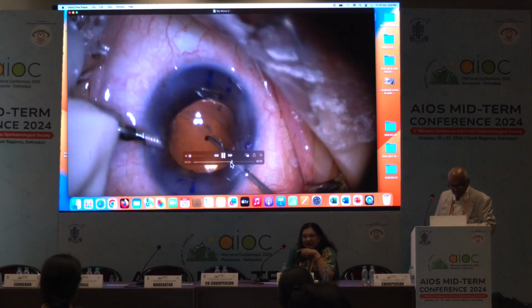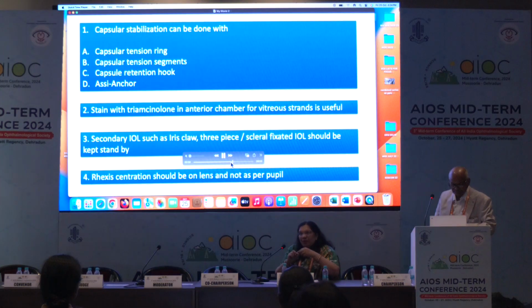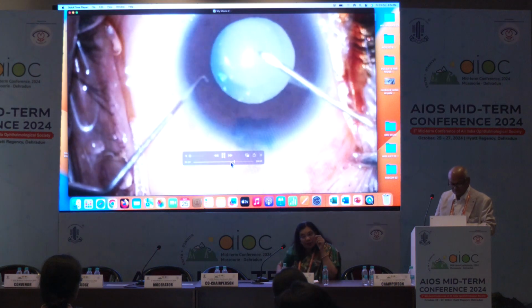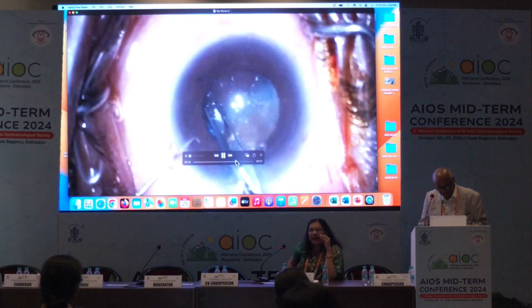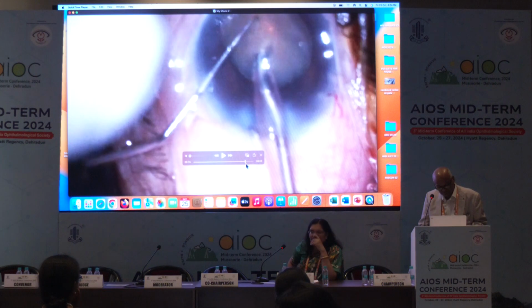One day my sister was assisting him, and he told me that she always puts the sleeve in such a way that the needle is exposed quite a bit. So you have to put the sleeve close to the tip, but still be able to do phaco. I used to always wonder, am I doing something wrong? Why am I getting so much phaco burn?